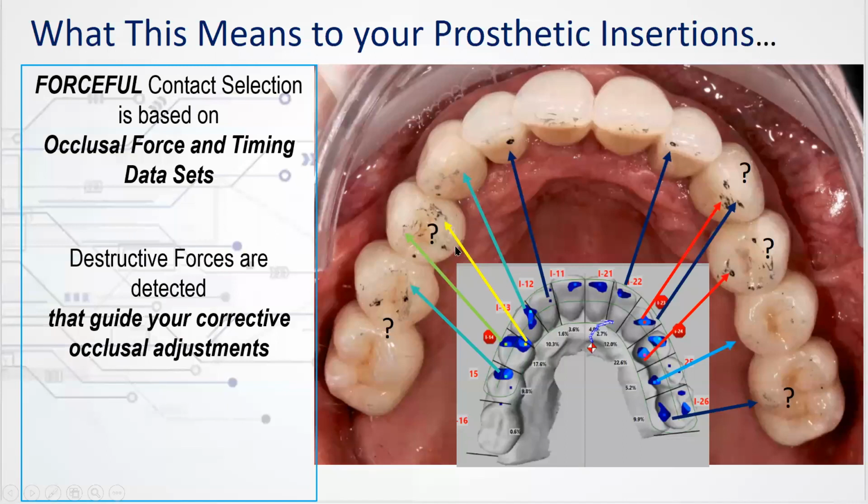And this is an interesting area, the mesial of this premolar, which is actually a supportive implant that's under overload. That's why there's an implant warning. The paper marks are really indiscriminate, and yet the mesiolingual area near the marginal ridge is very high force. And this is the question for you. How would you know that? How would you know which ones matter? This doesn't matter. This matters. You can't know. Ink spots don't tell you that information, and interpreting them becomes hit or miss.